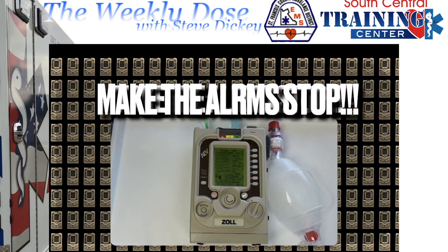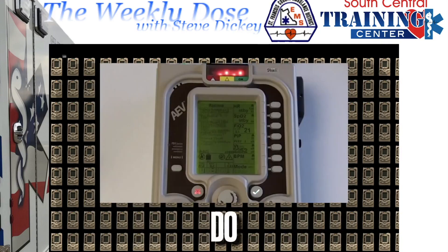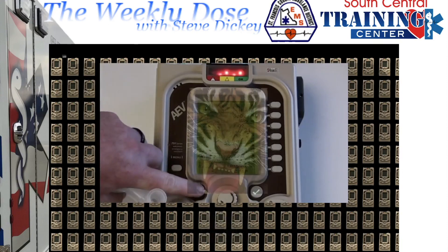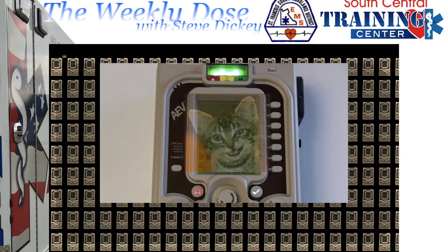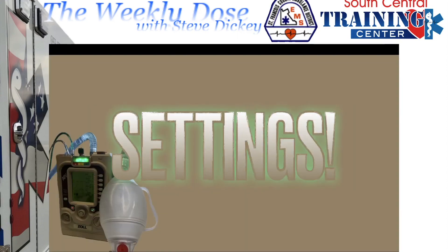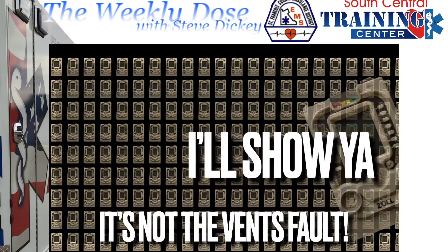Just make the alarms stop! There's no point to be afraid of this ventilator — it's not a tiger. It's actually a little pussycat. It's going to be okay. It's not the ventilator's fault; just adjust the settings. I'll show you.